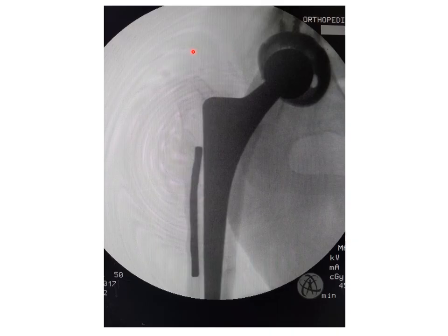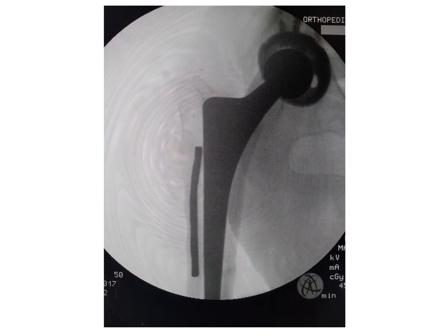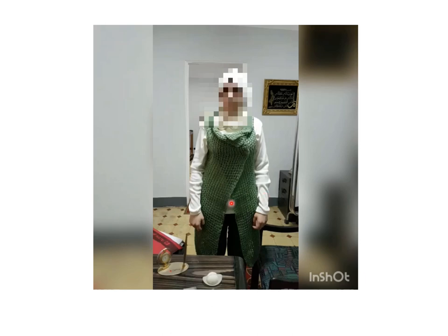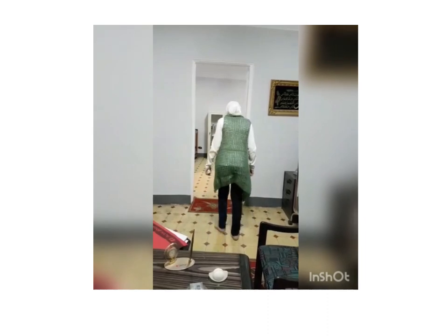I'd like to show this image intensifier view, which clearly shows how the plate is not touching the stem, thus avoiding a battery effect which would lead to erosion of both metals. This is 18 months after the operation — still doing quite well, x-ray looks nice, everything in position, no loosening, and the patient is quite happy.